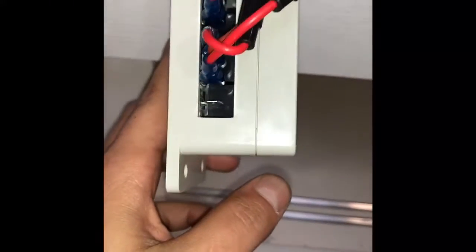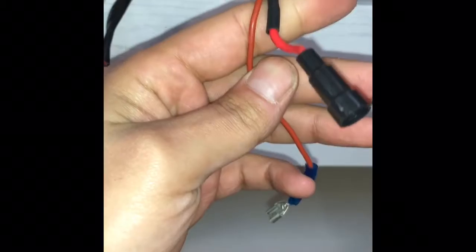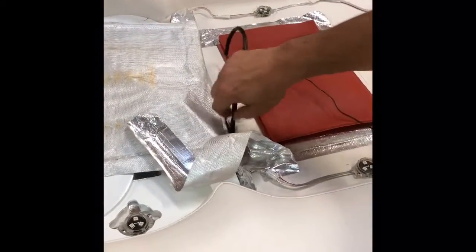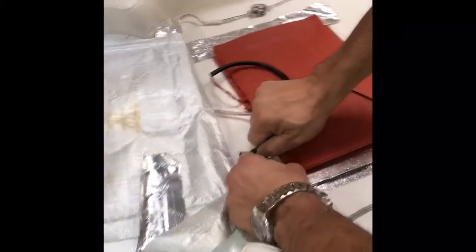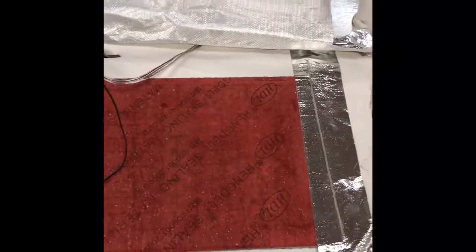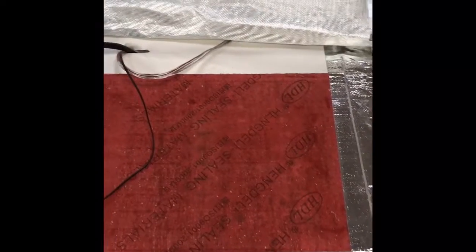You're gonna go ahead and simply gently pull it out, and you're gonna have these two cables right next to each other. So you can go ahead and pull the cables up now easily, since it's already been released from the module box. And once those cables are out and disconnected, we're gonna go ahead and put in a new heating pad. And we're gonna basically be doing the same thing here. We're gonna go ahead and remove the old one, and the same way that we disconnected it, we're gonna put it back in.